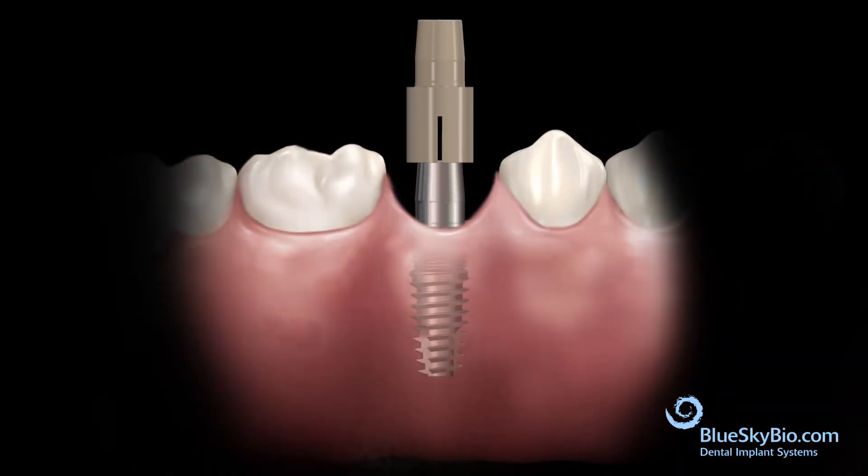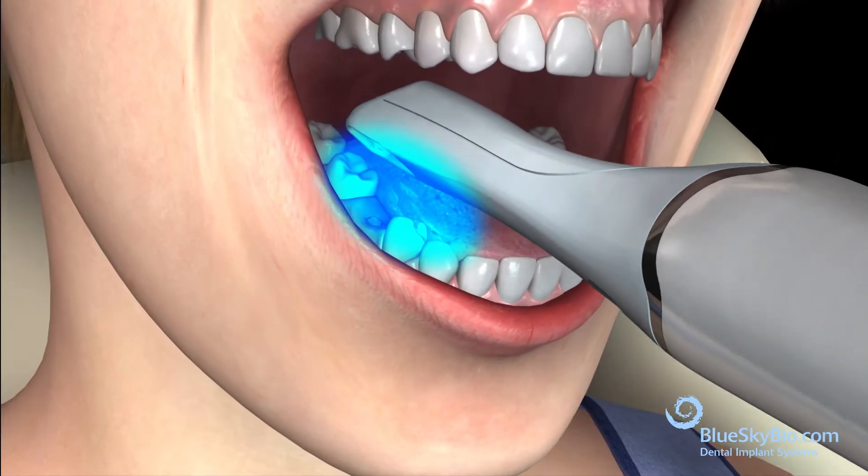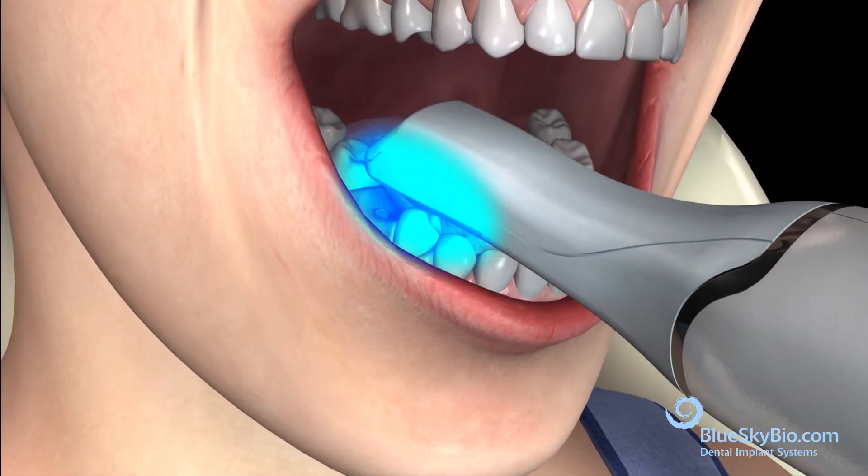Remove the scan post assembly and the titanium base abutment. Scan the tissue directly over the implant to capture the soft tissue geometry.